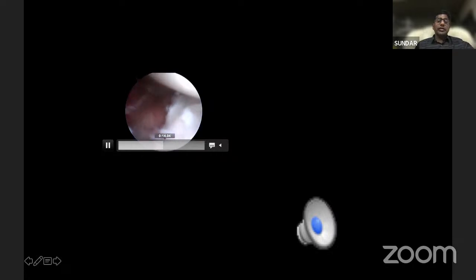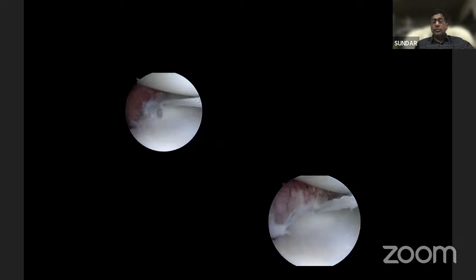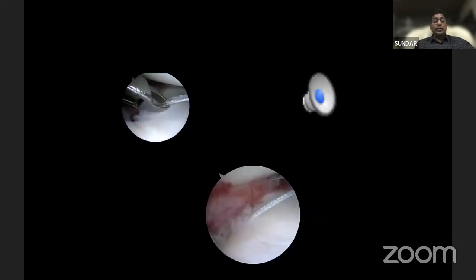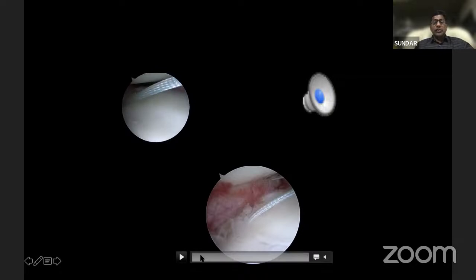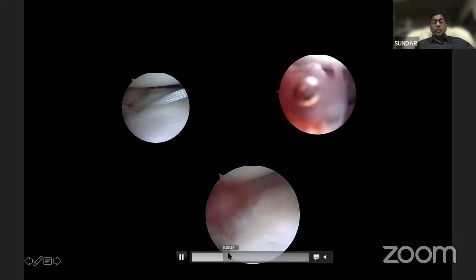It's sometimes very difficult. This is the most critical step. Take your time. Gently, I usually prefer to use the 25 degree lasso, but you can use even 45. But 25 is easy to use, and because of the short lever arm, you can slowly bring it up, touch the bone, don't go and paste the bone, it will block it. You can bring it up like this, and you can see that my guide wire comes, then you shuttle with your suture. Always, I prefer to do knotted sutures for this 5 o'clock and 7 o'clock position, so that your shift and control is easier rather than the knotless technique. Because this is a very, very crucial step. So make sure that you are pushing the knot through the post suture on the labral side.